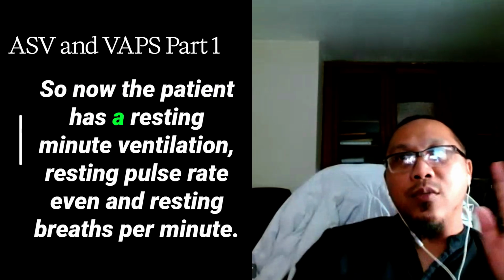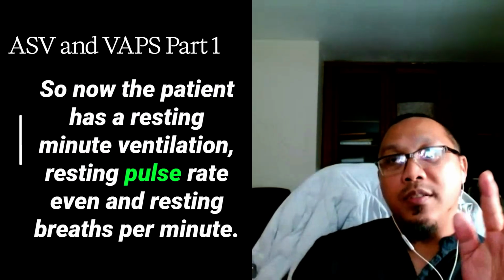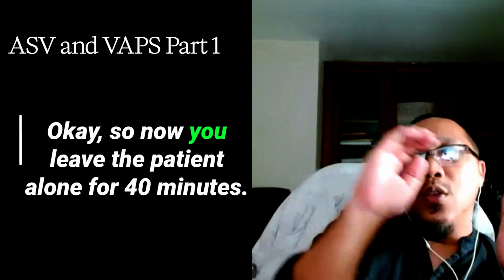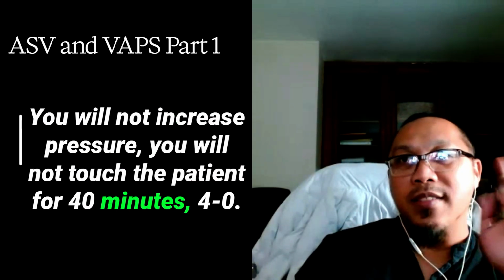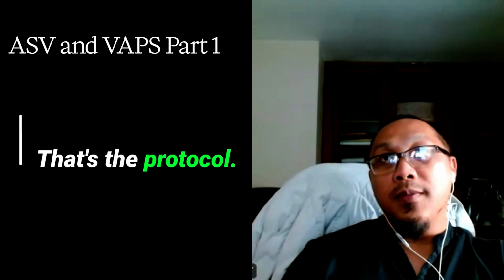Lights out. So now the patient has a resting minute ventilation, resting pulse rate even, and resting breaths per minute. Okay. So now you leave the patient alone for 40 minutes. You will not increase pressure. You will not touch the patient for 40 minutes, 40. Okay. That's the protocol.